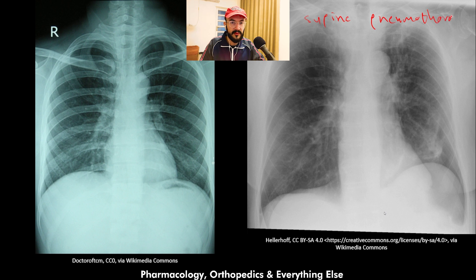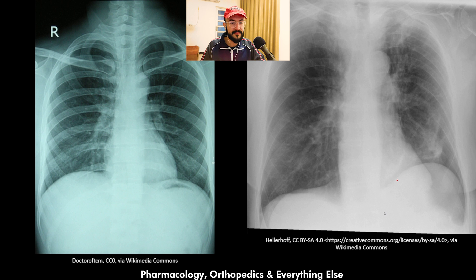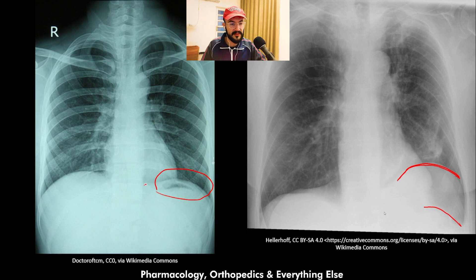Comparing the supine pneumothorax frontal chest x-ray with a normal chest x-ray: in the normal x-ray the costophrenic sulcus is narrow on both sides, while in the pneumothorax x-ray the left costophrenic sulcus is very deep — the deep sulcus sign. On the pneumothorax x-ray the diaphragm is sharp and transparent, compared to the blurry diaphragm on the normal x-ray. The pneumothorax x-ray also shows the double diaphragm sign with two visible diaphragm lines, whereas the normal x-ray shows only one.